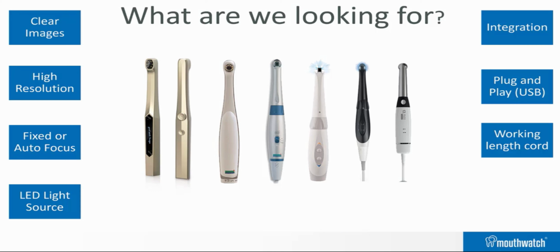Now, there are options for USB extension cords that will increase the length of that cord if you don't have enough length. We want to make sure our cameras are easy to use. Cameras on the market range in complexity, and generally speaking, the more complex the camera, the more difficult it is going to be to use.